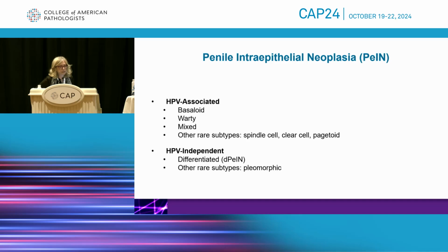Okay, so a few words on PIN in the penis. We really don't use the terminology squamous cell carcinoma in situ anymore, but we use this WHO-accepted terminology, which is penile intraepithelial neoplasia. And similar to its invasive counterpart, it is classified into HPV-associated and HPV-independent, with the associated being classified into basaloid, warty, and mixed, mostly, with other rare subtypes, and then HPV-independent really being differentiated PIN.